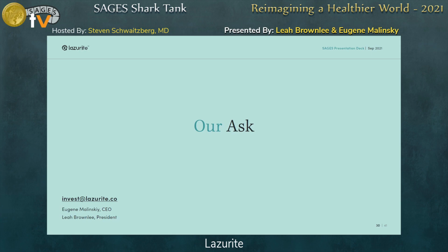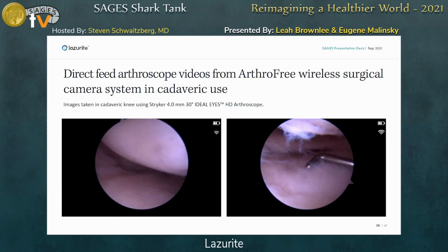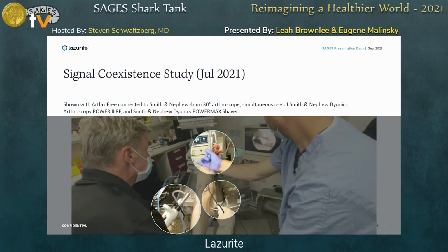Very interesting device. Thank you for a very nice presentation. The operating room is full of all kinds of sources of radio frequency interference, most particularly from electrosurgical devices. And how concerned do we need to be about the possibility that using a Bovie device is going to cause interference to these wireless signals?